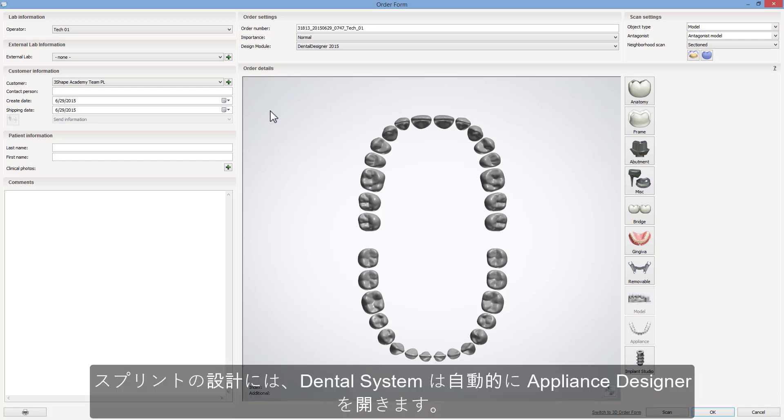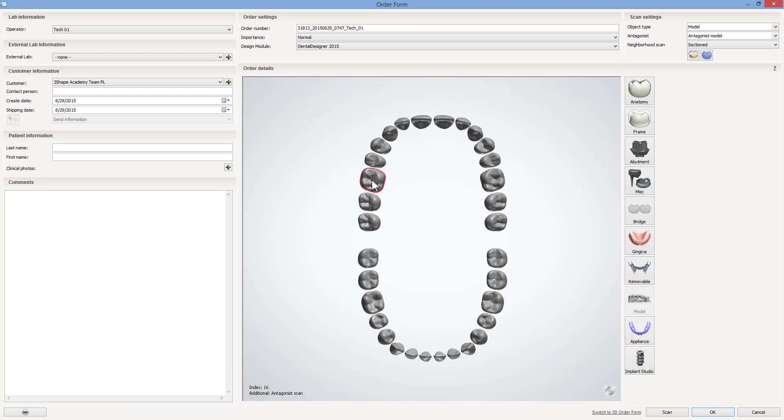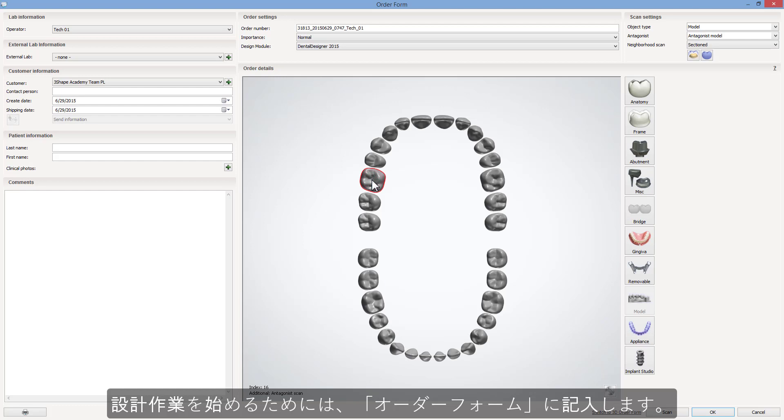For splints design, dental system will automatically move to appliance designer. To start your design, fill in the order form.